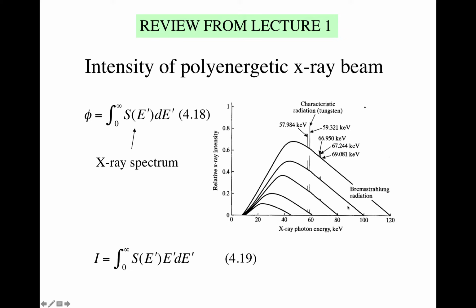Now, what happens is as the X-rays exit the target material itself, the target material will absorb some of them, the lower energy X-rays, and the glass on the outside of the vacuum tube will absorb some of them. Then you actually put a filter, a very thin film of copper or aluminum or something, to also filter out lower energy X-rays so they don't hit the patient. So you wind up with something that looks like this.